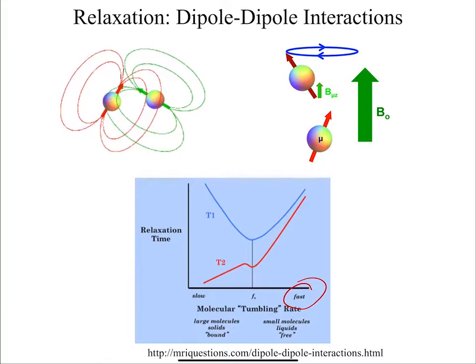It's even decaying away so fast as you're trying to tip it, it's dephasing. So it's actually quite a challenging problem. Yep.